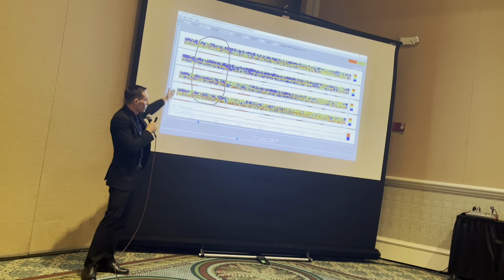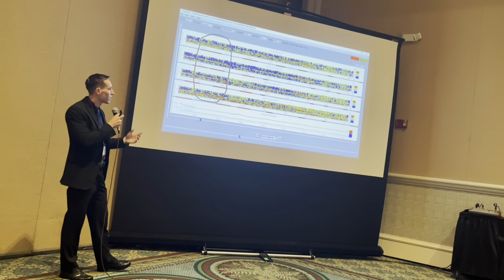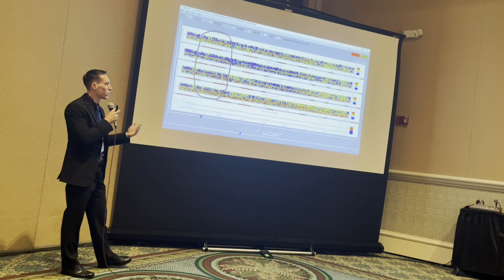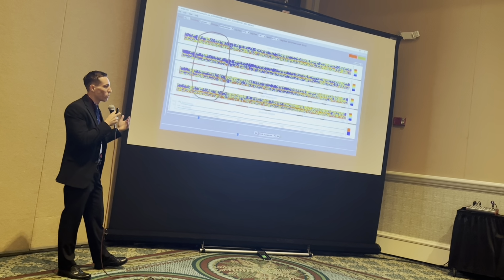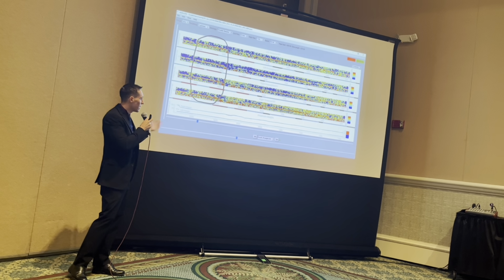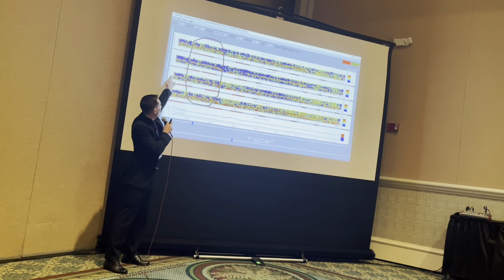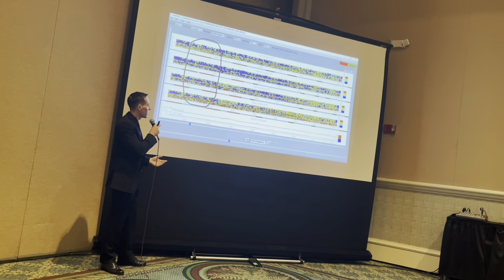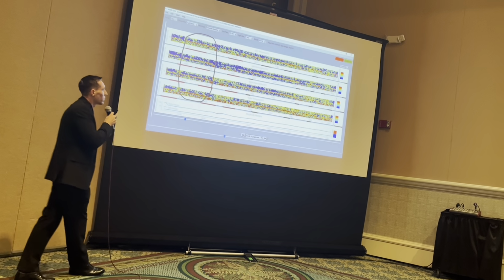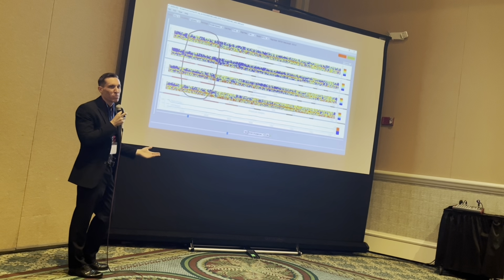And the reason for splitting it up like this is so that if there are any focal abnormalities, if anything's different in any of these different panels, it'll jump out to you as a focal abnormality happening in one specific area. But in this example, this is a normal EEG on quantitative EEG. You can see in the middle of each of the frequency graphs, it's at 10 waves per second, a very normal EEG. There's a little bit of noise intermixed around it, but that's normal for us to see.